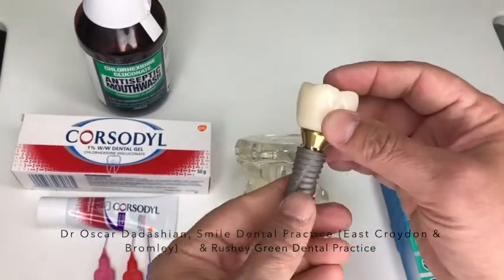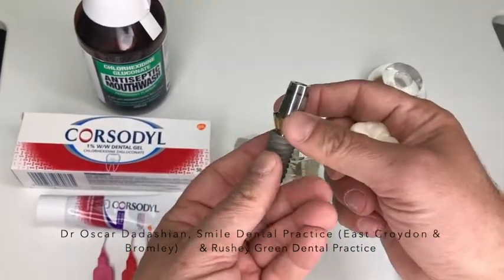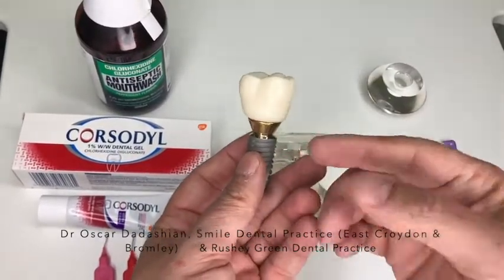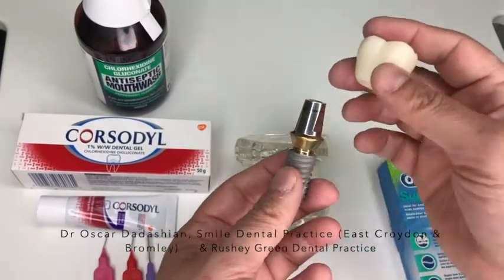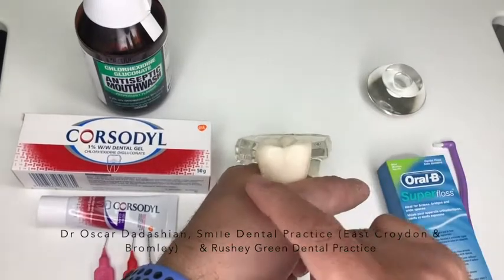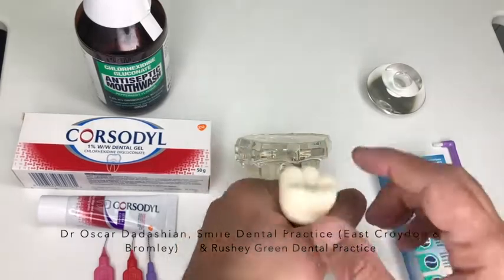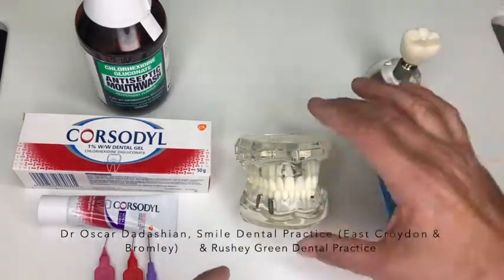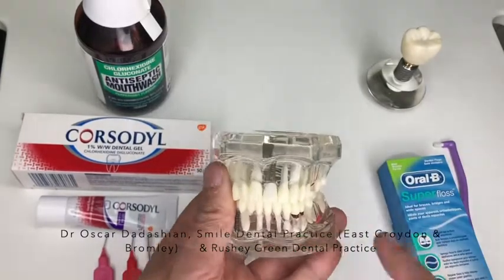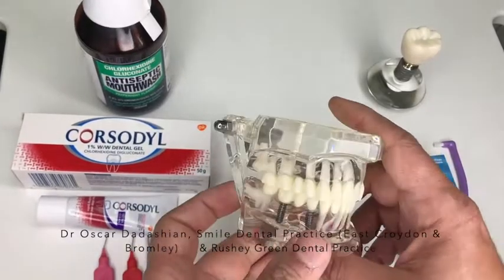So just to reassure you, often it's the screw in here that holds the abutment and the crown in place. Often that goes loose, and it's a very simple thing to fix. So please don't worry about it. And if this is underneath your gum, the only thing you can do is make sure you keep that area very nice and clean around it. Get your interdental brushes in between. I've made another video where I showed how to put your super floss underneath to clean, how to use your interdental brushes to clean underneath.